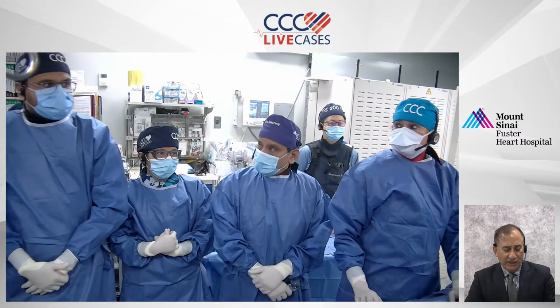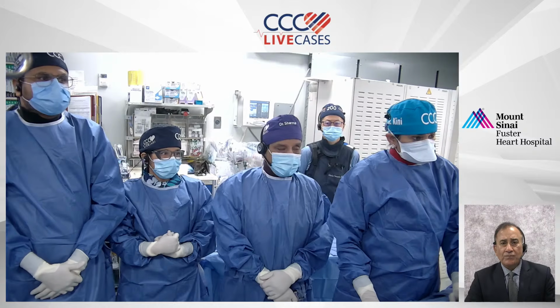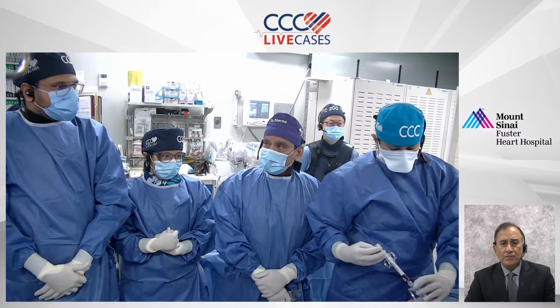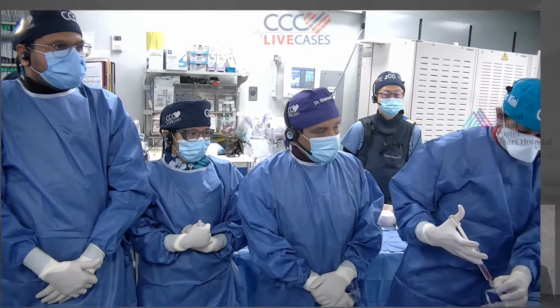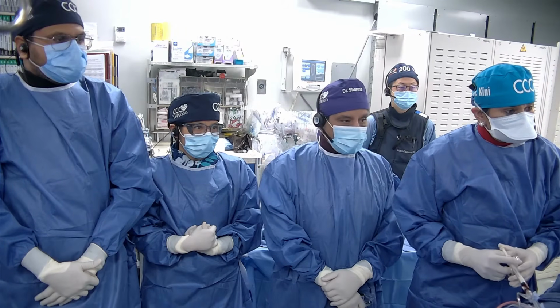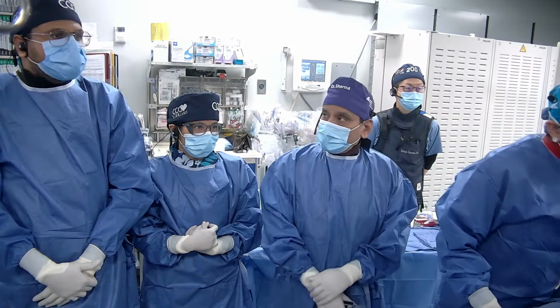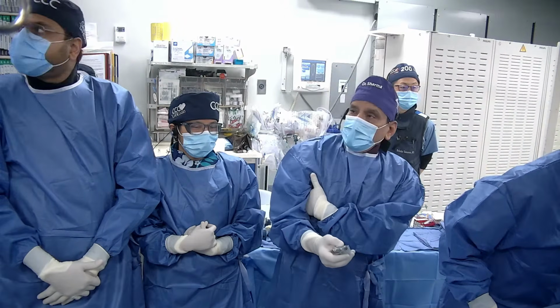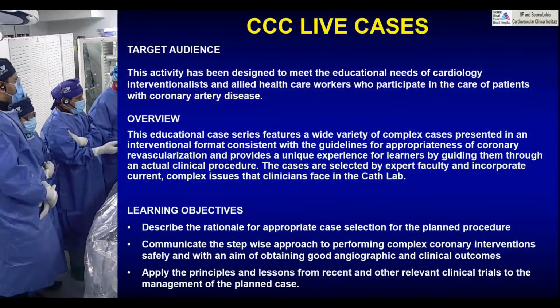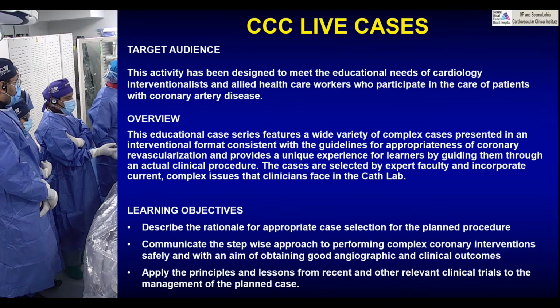Good morning, and we are right on time. And of course, we keep trying to show the latest and more complex cases. This is one of them, which is a trifurcation. The question always comes up of what to do in these cases, and this is the case which we are going to share very quickly.